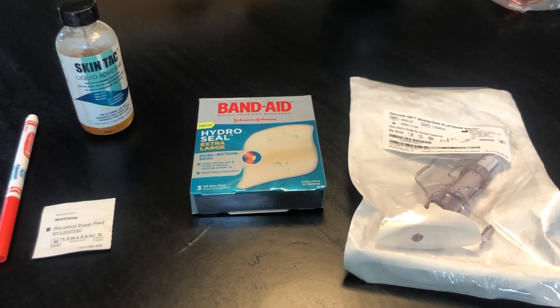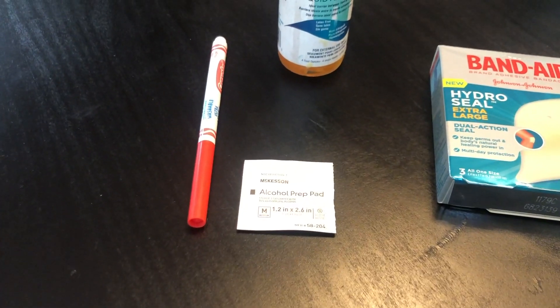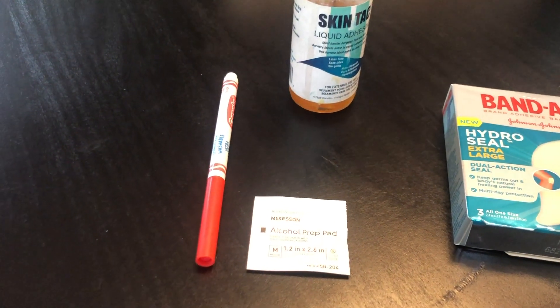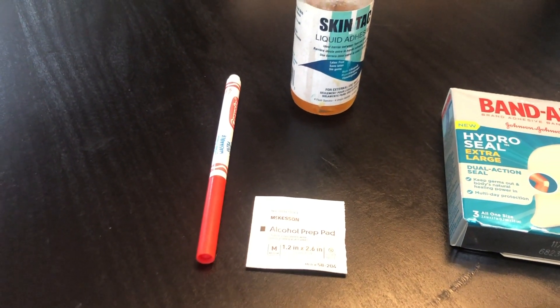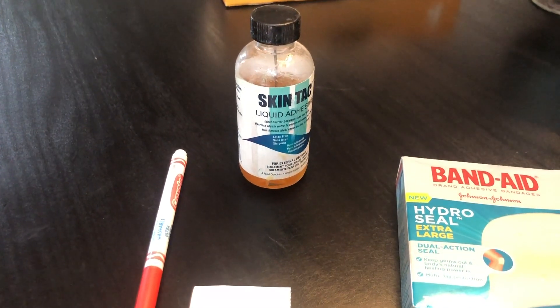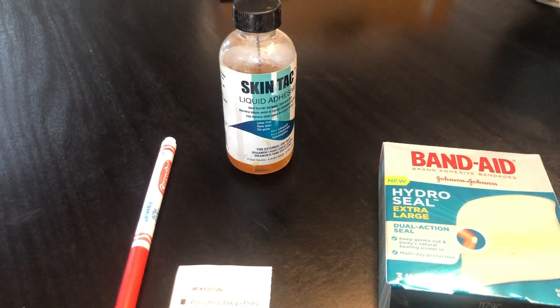Some of the things you'll need for this step: an alcohol wipe for prepping and cleaning the skin, a washable marker to mark the skin where I'm going to place the pad, and SkinTac, which is a great adhesive to prep the site and make sure the hydrocolloid bandage stays in place.